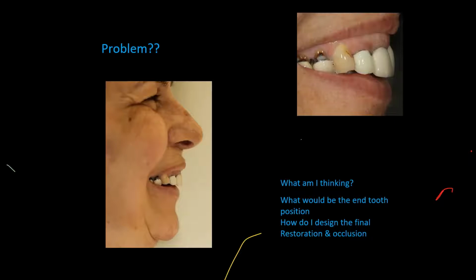So we have to think of the soft tissues that are surrounding, draping the hard tissues. If you decide to mount the articulators, you have to see how much chin deviation you have and how much you might exaggerate the anterior overbite and overjet. I can deal with the overbite, but there are no overjet issues. Then, when you open the bite, for instance, in a class 2 patient, what's really happening is you lose your anterior coupling. And if you lose your anterior coupling, how are you going to deal with that, especially canine guidance, which you want to establish? Where would your guidance be when you have to lose the upper premolars, for instance? How would you define your occlusion? How do you design your occlusion prescription? So all these are very important considerations.